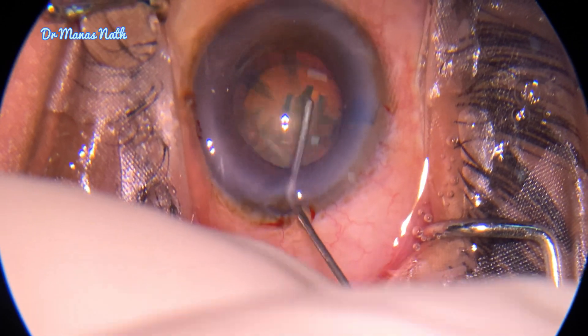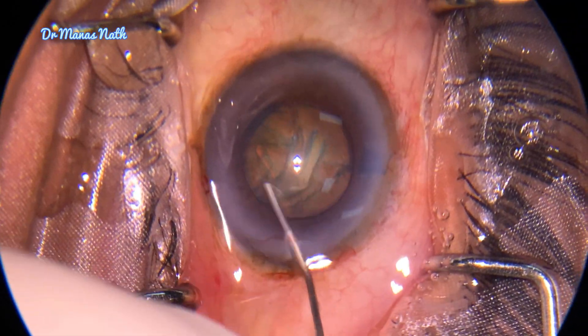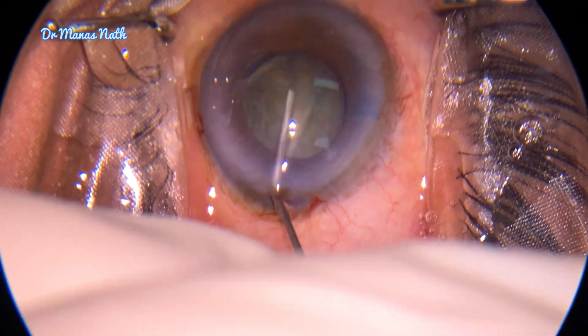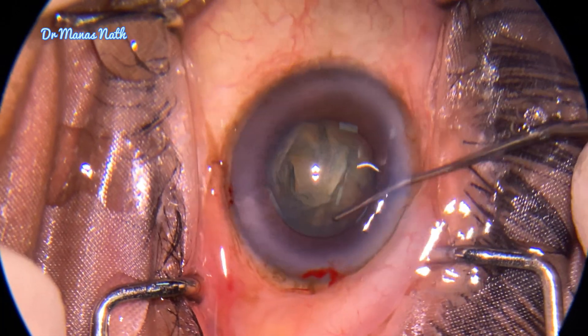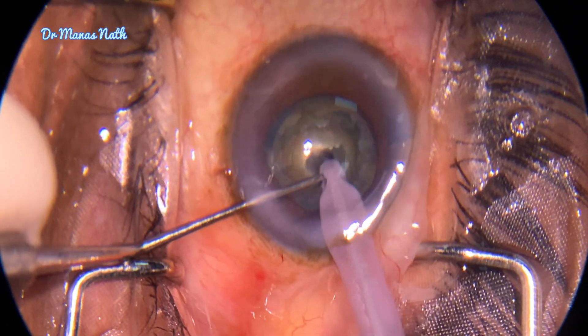After doing hydrodissection, when I was trying to do the nucleus rotation, the main challenge came — the nucleus did not rotate as the zonules were quite weak. I decided to try once again, but the result was the same. So I thought I'd start phacoemulsification, thinking that once I debulk the cataract the nucleus may start rotating.